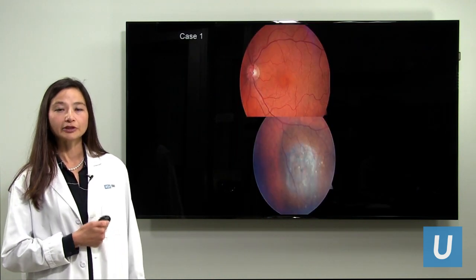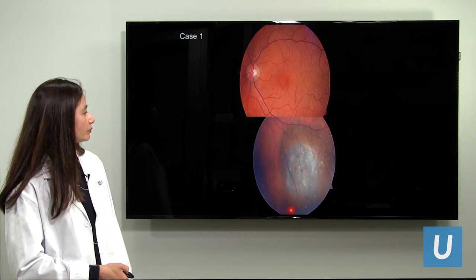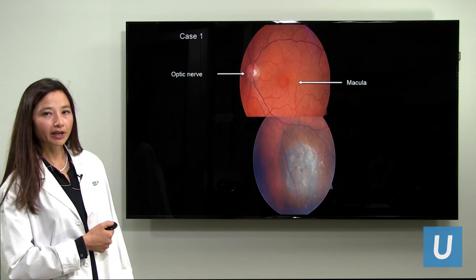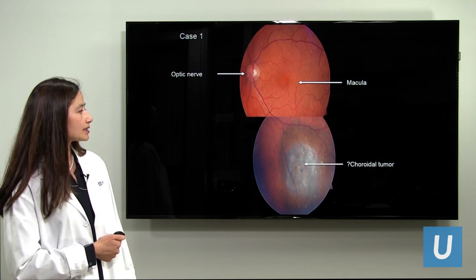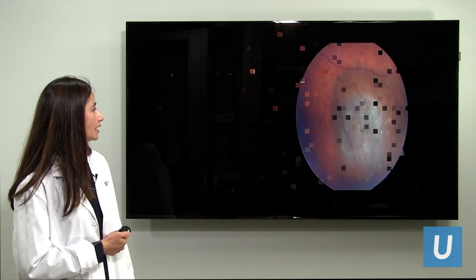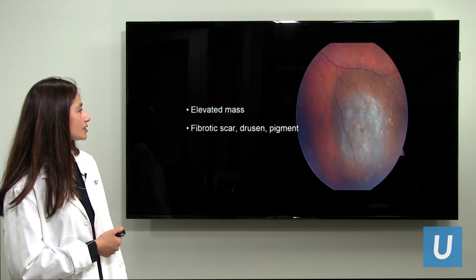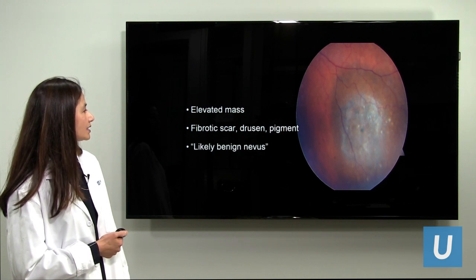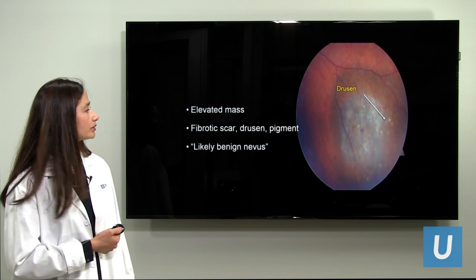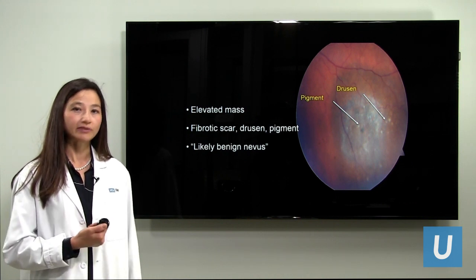Here is a case of a gentleman in his 70s found to have a pigmented lesion. Here is the optic nerve. The macula is the central area without vessels — that's the center of vision — and here is a possible choroidal tumor. The question is whether this is a melanoma or something benign. Taking a closer look, the lesion is elevated. It looks like there is a scar or some yellow tissue on it, along with drusen and pigment. Drusen are findings that require a long period of time to develop, as does focal pigmentation — signs that might suggest a benign lesion.